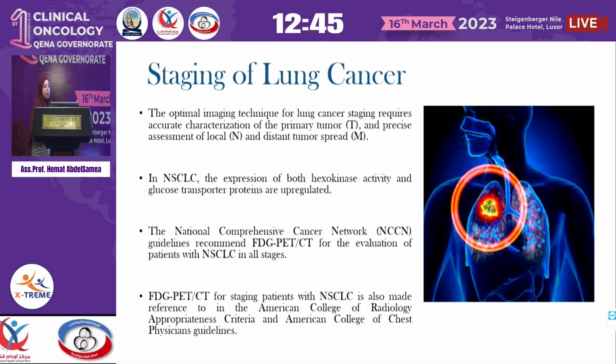In non-small cell lung cancer, the expression of both hexokinase activity and glucose transporter proteins are upregulated. This leads to increased uptake of fluorine-18 FDG. The National Comprehensive Cancer Network guidelines recommend FDG PET-CT for the evaluation of patients with non-small cell cancer in all stages. FDG PET-CT for staging of patients is also referenced in the American College of Radiology appropriateness criteria and American College of Chest Physicians guidelines.